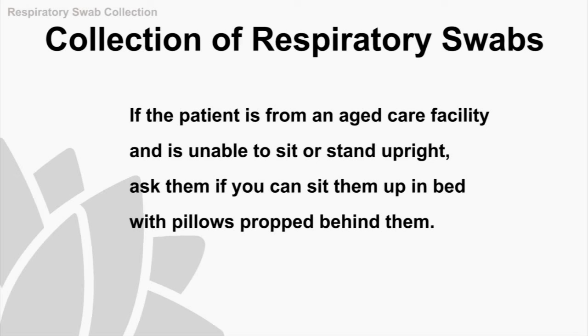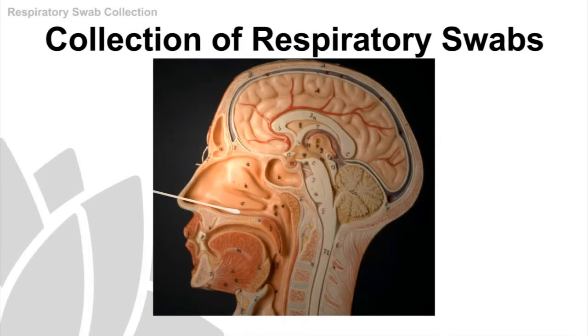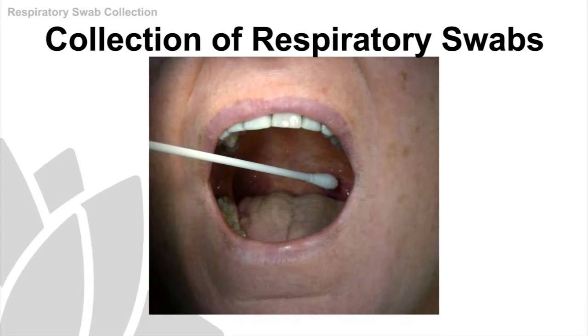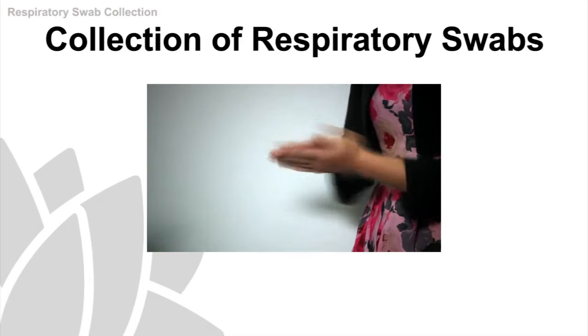If the patient is from an aged care facility and is unable to sit or stand upright, ask them if they can sit up in bed with pillows for a while. You're going to stand to one side of them and place your non-dominant hand on their forehead and insert a swab into their nose, only two or three centimetres. Explain to the patient that this might be slightly uncomfortable and may cause their eyes to water.